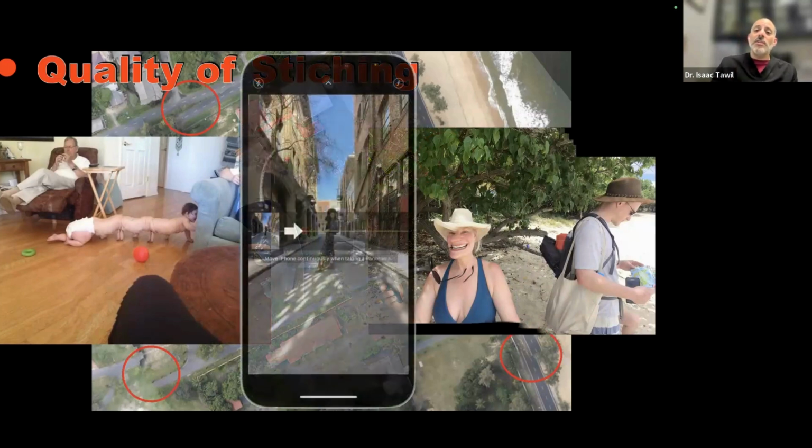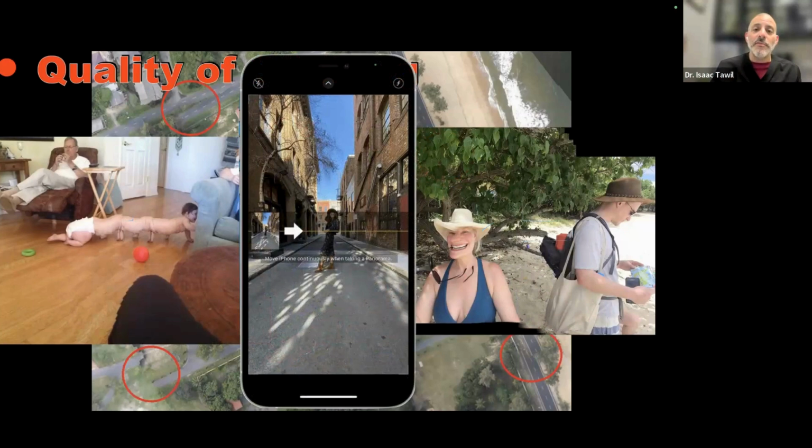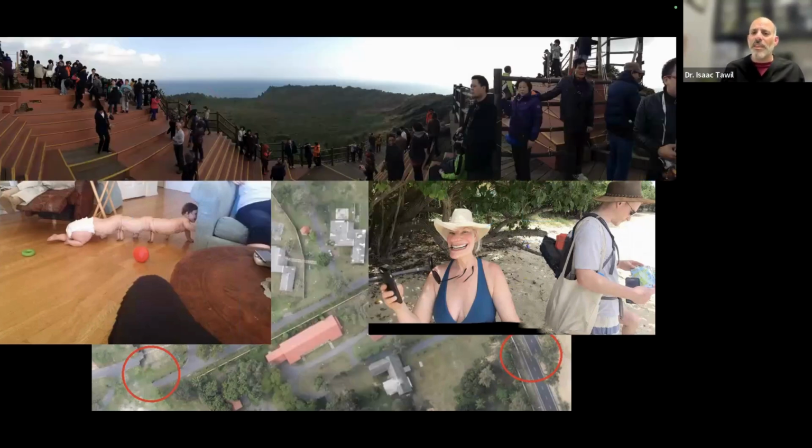So this is the problem with stitching, and we all have these panoramic phones, these iPhones and Androids that can stitch together nicely, and we see these beautiful pictures, and we look at them and they look like this. They say, "Wow, what a great picture!" But I'm looking at everything on the right and on the left, but everything was really just all in front of me, and it wasn't a U shape. Why is it U shaped? It's because it's stitching and it's building up and trying to build around this algorithm.